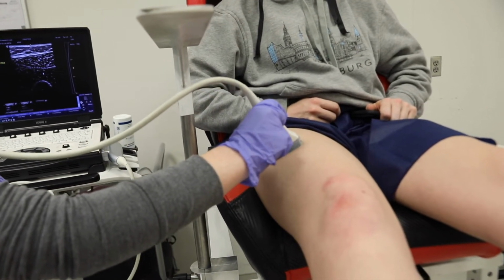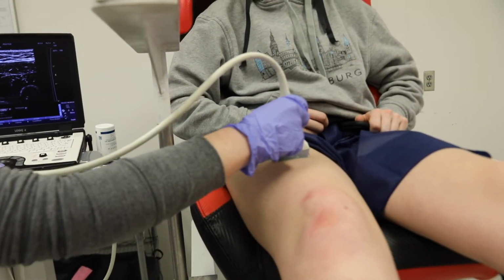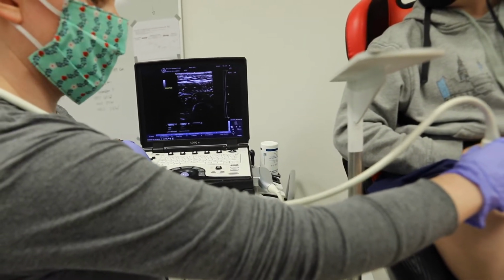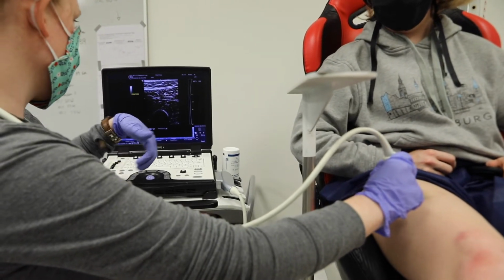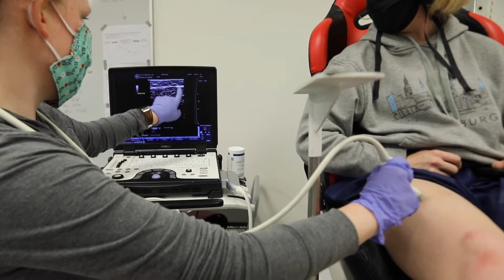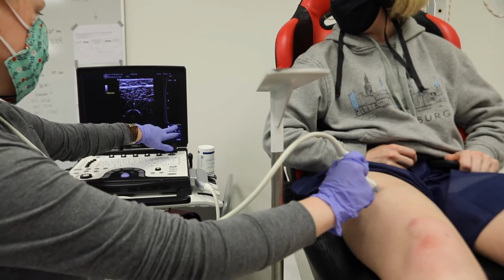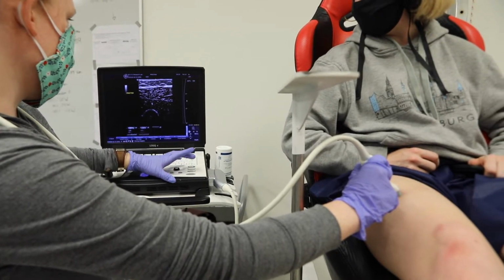You can double check it by going more to the center of their leg, so right above the kneecap. You usually can see these two circles of muscles on the screen, so you know that you're in the right place. And then you go more lateral again, and you should see the slanted line, and this is your vastus lateralis muscle. Once we're there, we're going to freeze, unfreeze, and hold it for 5 seconds, just so that we get a good recording of it. We'll store that.